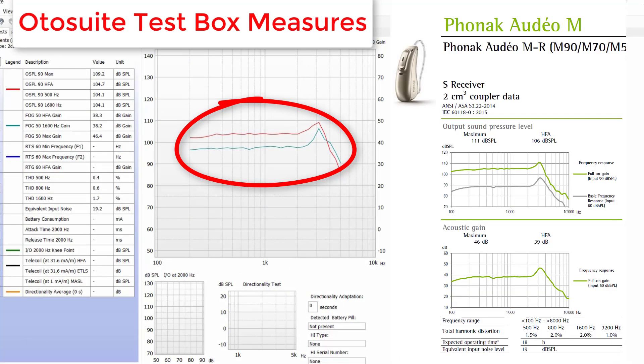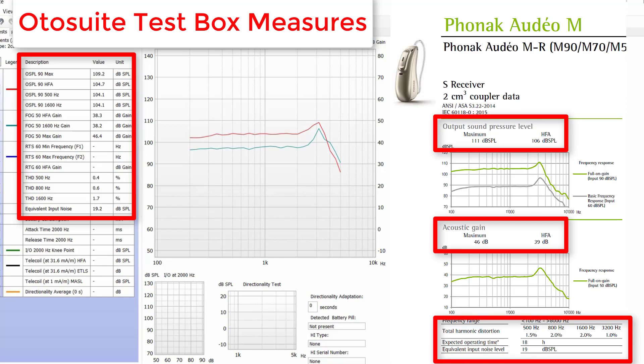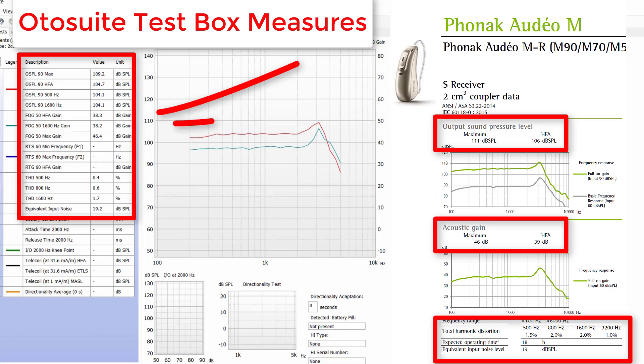This is what we use to compare the diagnostic readings recorded using the test box. The curves in the Otosuite software should resemble the curves on the manufacturer's specification sheet for the specific hearing aid and receiver power that we are testing. If we see something out of the ordinary, it can indicate that the hearing aid is not performing correctly. These numerical values should be within a certain tolerance range standardized by the American National Standards Institute, often abbreviated ANSI. If these values are within those specified tolerance ranges, then the devices are considered within specs and functioning properly.